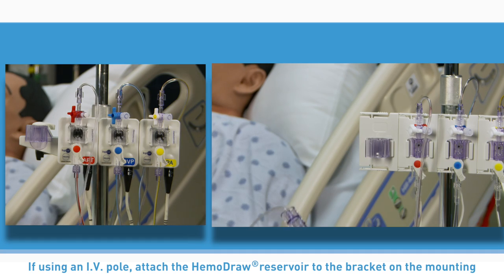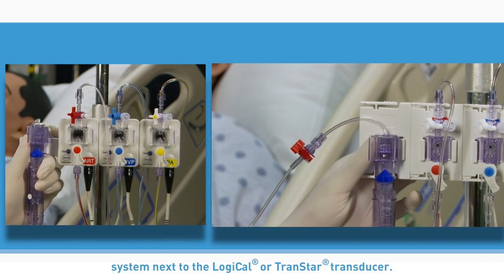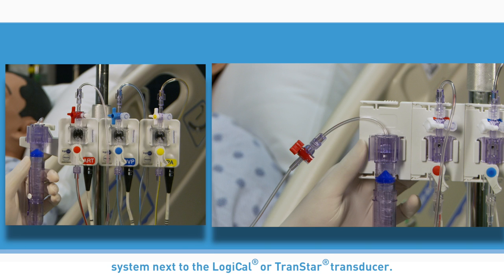If using an IV pole, attach the Hemodraw reservoir to the bracket on the mounting system next to the Logical or Transtar transducer.